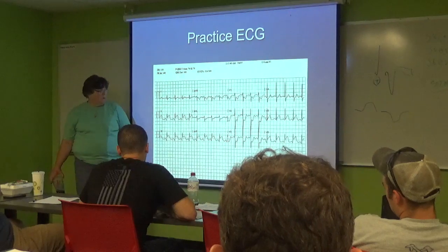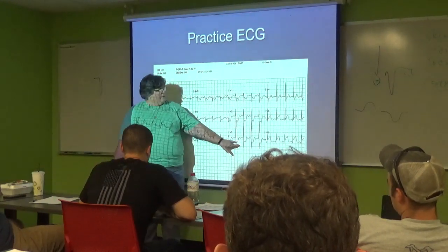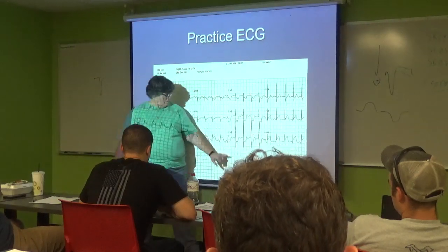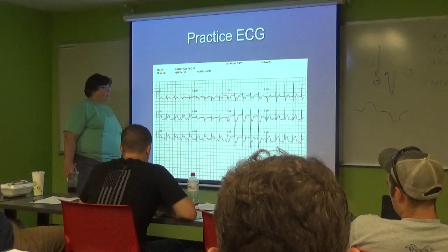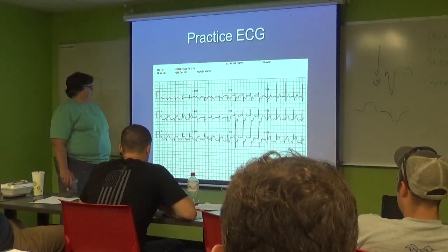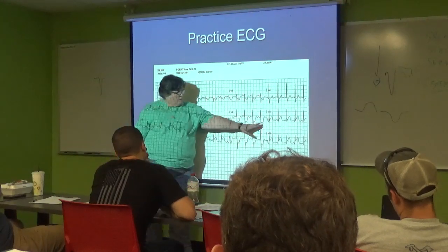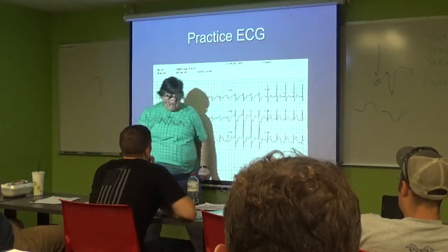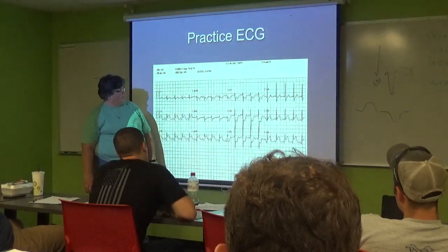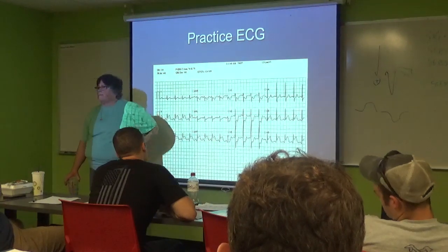Okay. Your anterior, which is what? V3, V4. You got depression. Okay. Your lateral, AVL, V5, V6. AVL? Yeah, depression. Elevation. Okay. Then you do your septal. Yep. You got V1, V2, you get depression in all those.